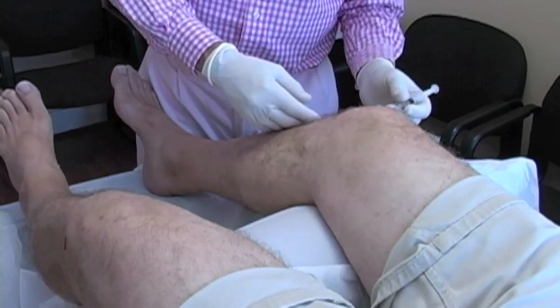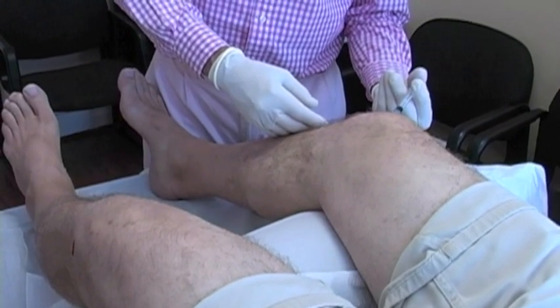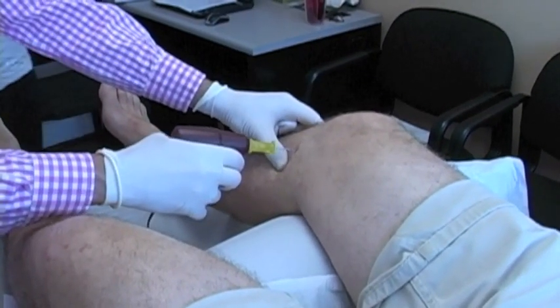Here I'm numbing up the knees. We put some novocaine solution into the joint before we inject the stem cell prolotherapy.